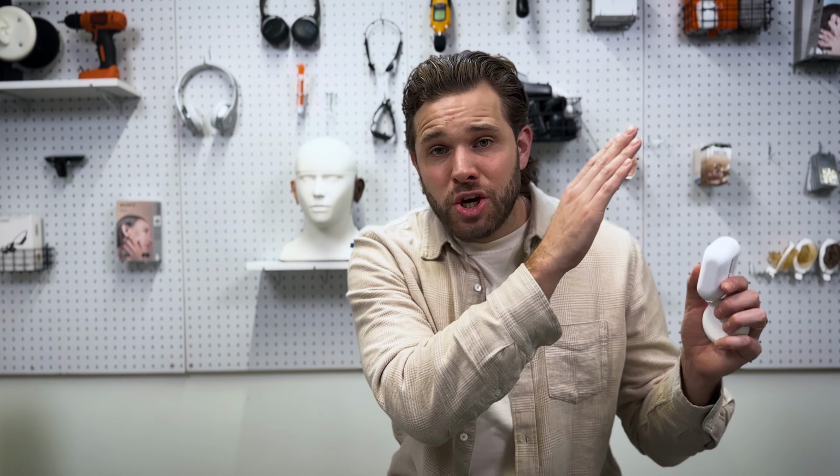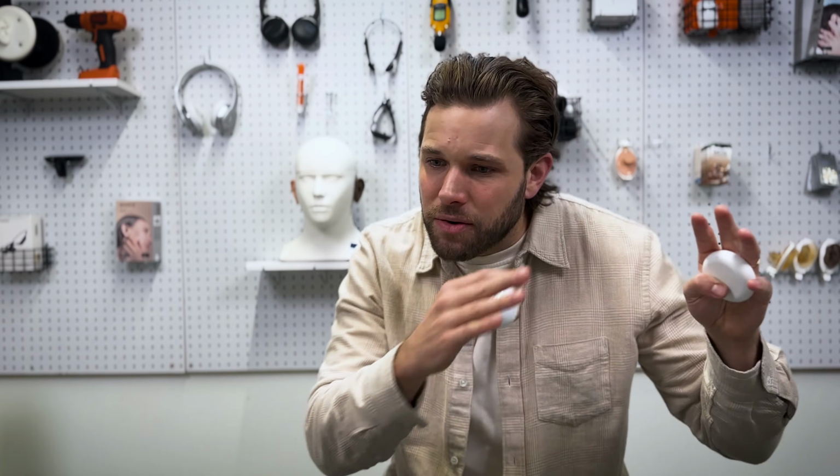Now, it's really important to note that MD Hearing does not allow customization to your specific hearing loss. So if you're just becoming familiar with the world of hearing health, it's important to know that if you were to take a hearing test, the shape of your hearing loss is unique. Every single person's is different. Mine goes down in the middle and comes back up. The MD hearing aids do not customize to your loss. Instead, they customize to common losses. So a common loss is a slope. This product probably customizes generally towards a slope. It's going to work for some people, but it won't be exactly to your custom specifications.